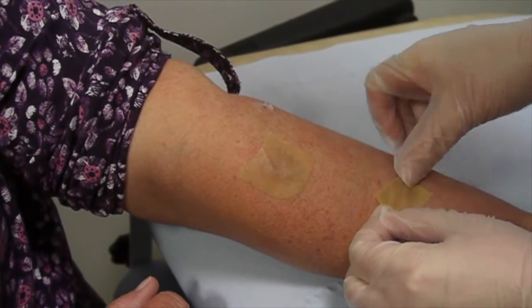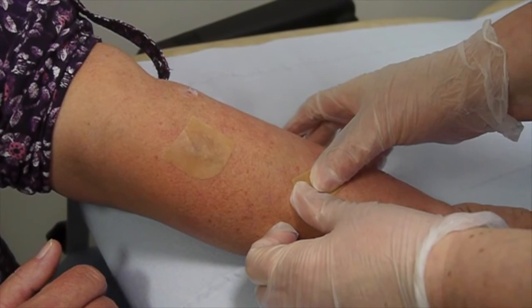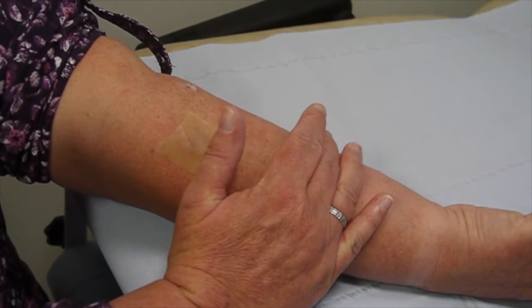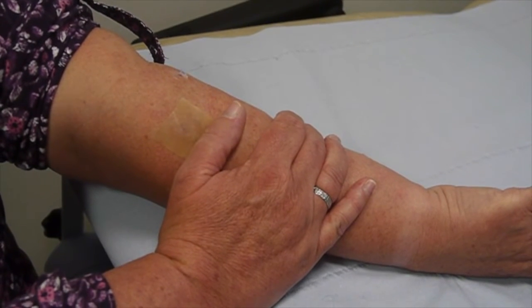These pieces of dressing can be left in place for two to three days. They're waterproof — you can bathe and shower with them. The hydrocolloid dressing can then be taken off, and hopefully the patches of eczema will be much less itchy and have flattened down. The whole process can be repeated for two or three occasions until the eczema settles.